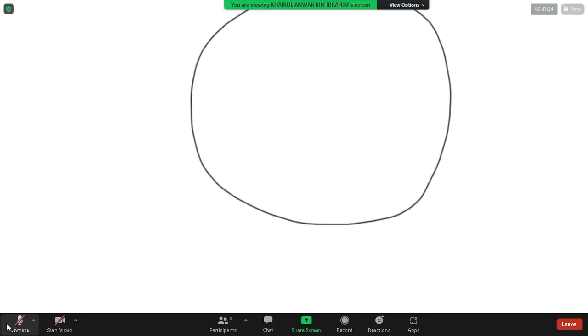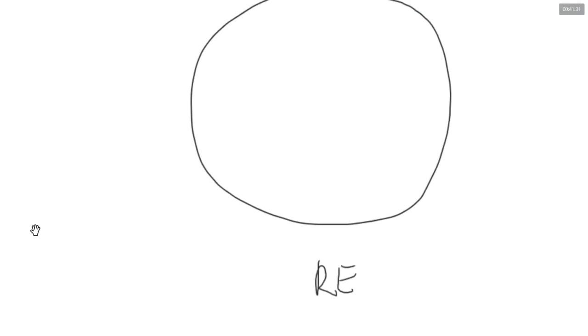So basically, I think in your logbook, they already give you a circle, right? So let's say this would be the right eye. Usually in the center would be your macula. If there's no abnormality in the macula, we usually use a cross, which means most of the time it is flat.